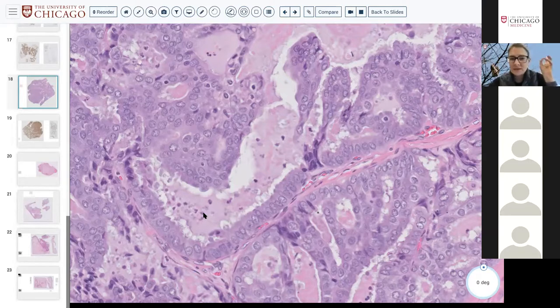If you're trying to identify zymogen granules in an acinar type of morphology, it should be intracytoplasmic. So telling me that this is mucoid material doesn't really help me, because you can have a lot of mucoid types of materials, and without it actually being expressed in the cell cytoplasm, it's less helpful.